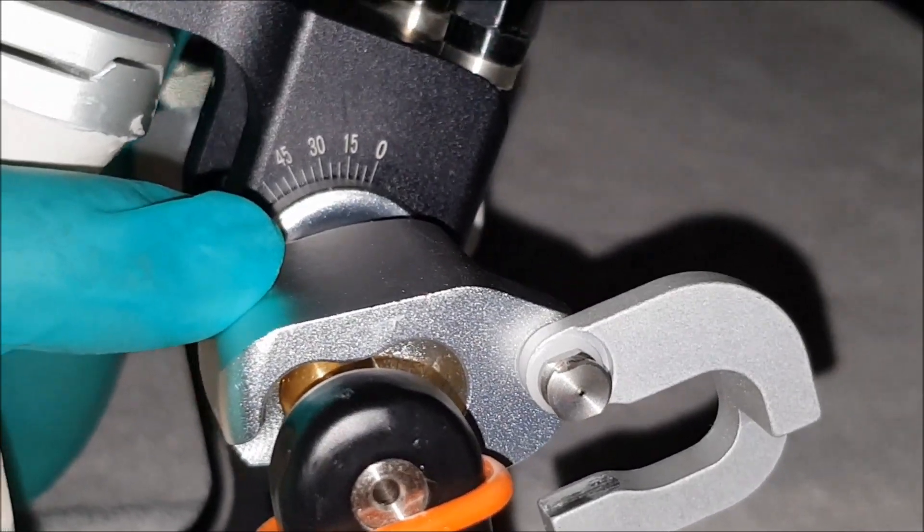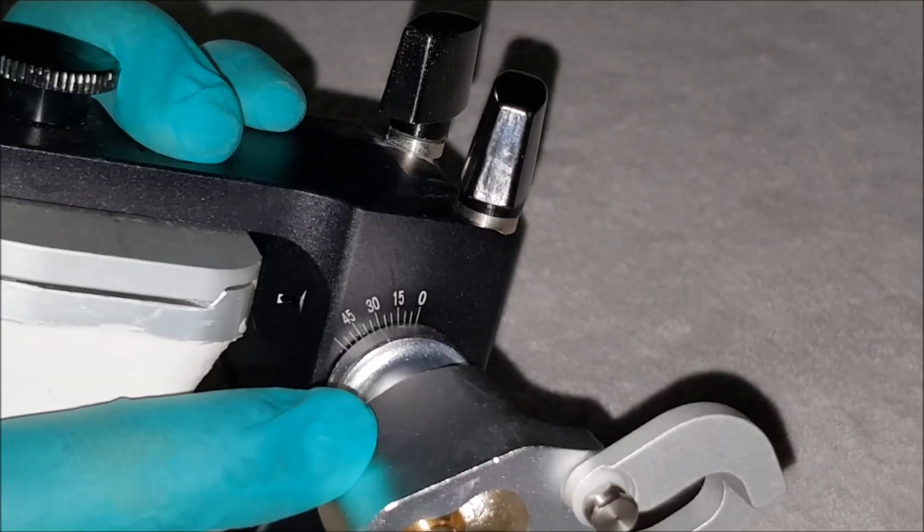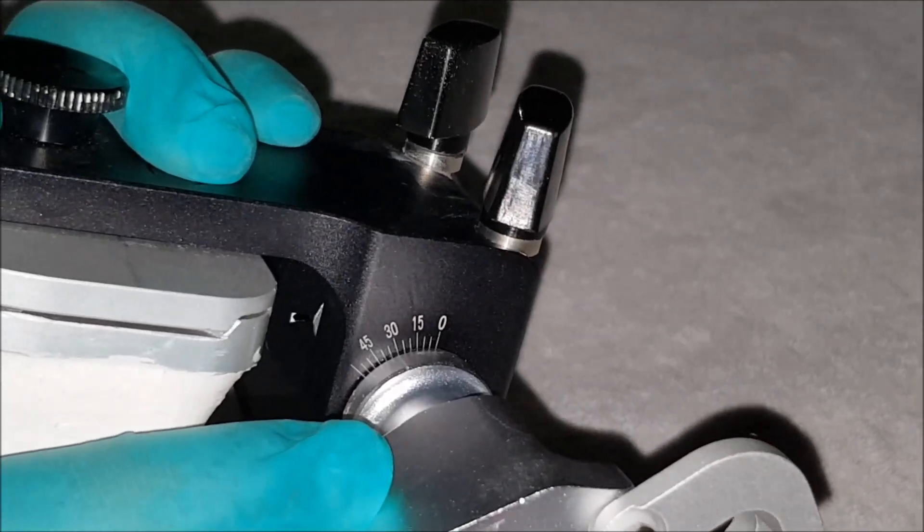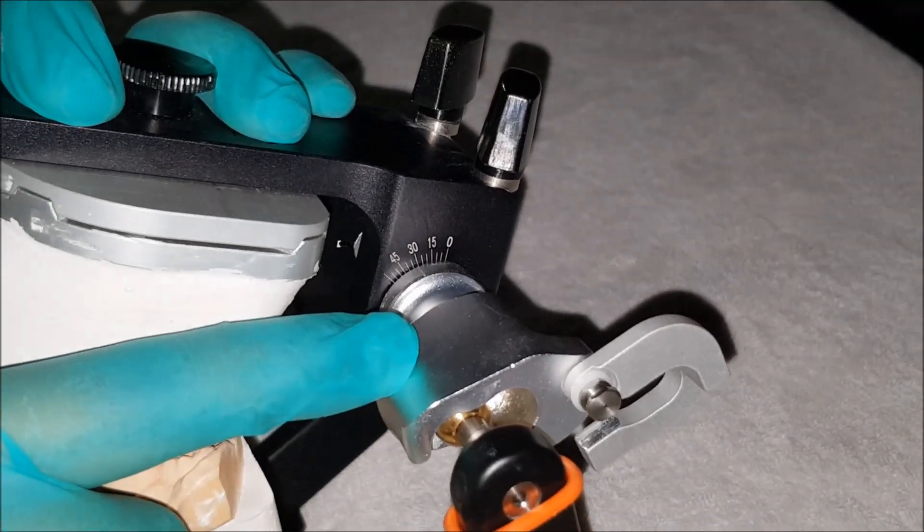The moment I have this, I once again go ahead and lock the condylar lock. This means the H value on this side on the articulator is locked. I go ahead and repeat the exact same thing on the other side.